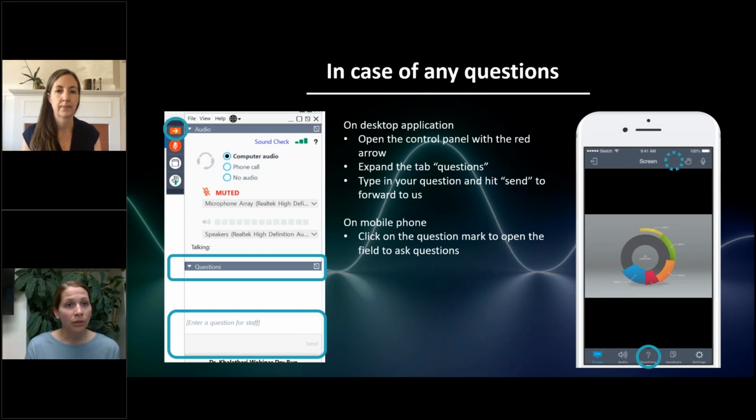Thank you. Next question: photopic negative response is measured at 72 milliseconds or at minimum time. Which one do you prefer and why? We prefer the one that works the best. For the initial desktop work, we did minimum time. For the work that we did in our larger study using a sort of potpourri of optic neuropathy patients that we presented a couple of times at ARVO but haven't published yet, we looked at both the 72 millisecond minimum, which we found wasn't super reliable because sometimes if there was a little bit of noise right at that point, it would not be accurate. So we would go more with a minimum time. And then we also looked at the P ratios and W ratios, the goal of which is to normalize it to some of the other amplitudes in the waveform, specifically the B wave and the A wave.